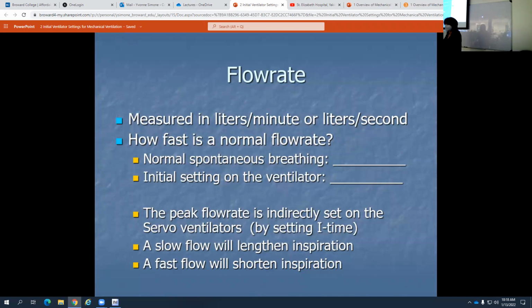No. If you did, you don't remember? Is it 20? I feel like it's 20. Yeah, 30 liters a minute is a normal flow when we're breathing in. So anytime you're figuring out if a venti mask has enough flow rate coming in, you want to make sure it's greater than 30 liters a minute. Does that ring a bell? Yeah, so normal spontaneous breathing, 30 liters per minute when you're breathing in. And that comes out to about 500 mLs in 1 second.